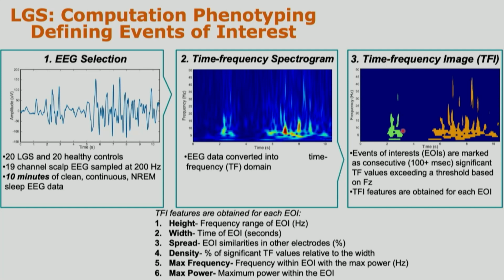And this is just a way that we can objectively and autonomously identify interesting waveforms in the EEGs of kids with LGS. So the goal here was to say, okay, can we find a way to algorithmically pull out the GPFA, the slow spike and wave, the tonic seizures, and other things like slowing that maybe visually we're not as good as epileptologists at identifying.